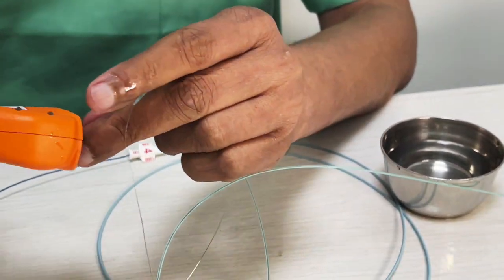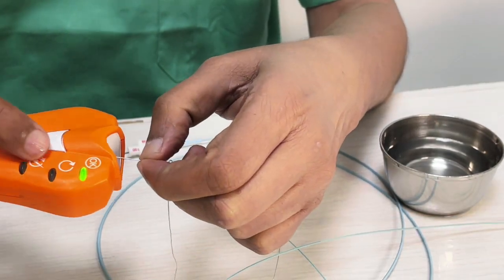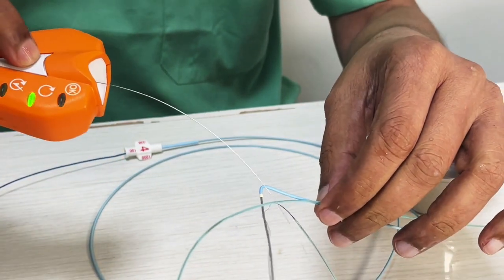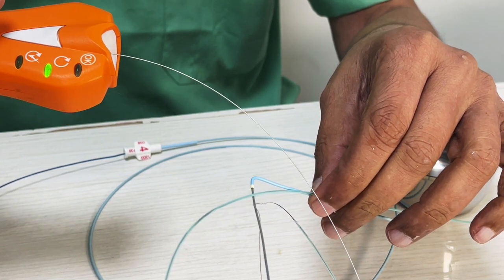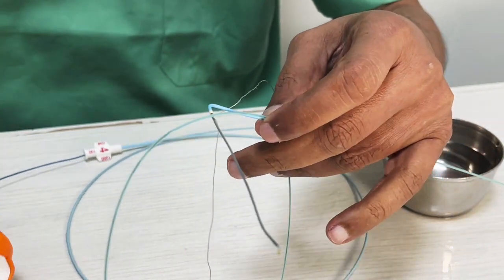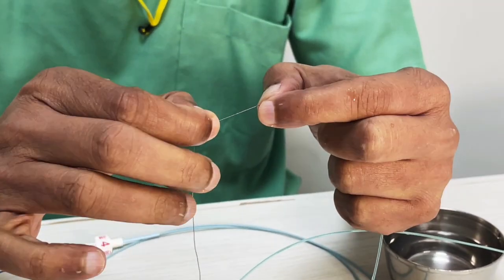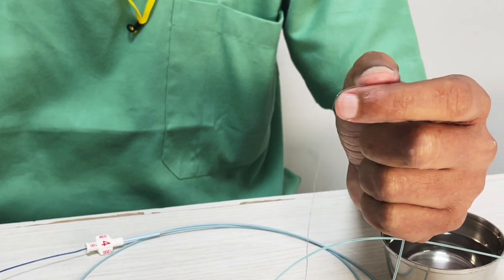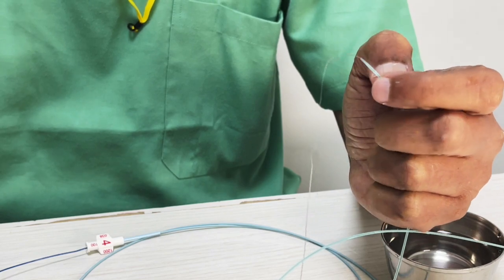So right now this is out. You take this device. This is of course the Stryker detachment, and it basically shows if there is a fault in the coil. So you just press it. If it detaches, it detaches. I'm not sure if it is detached because we destroyed it completely. It is not detached, but technically it will detach at this point. See, it doesn't detach because the integrity of the coil is probably gone, right? But remember, inside a micro it won't. It has to come out to detach.